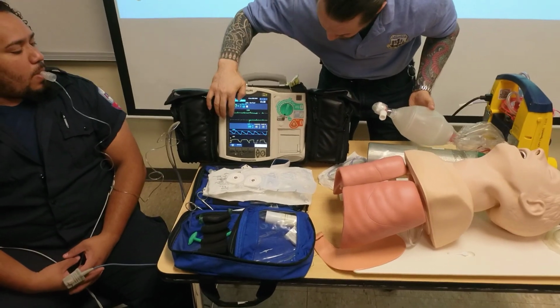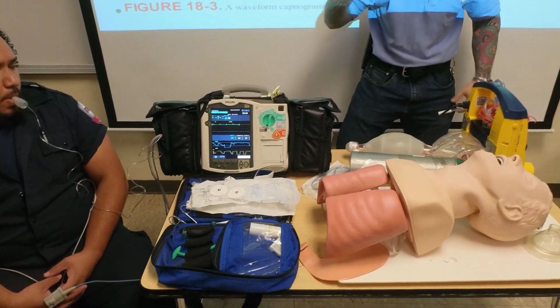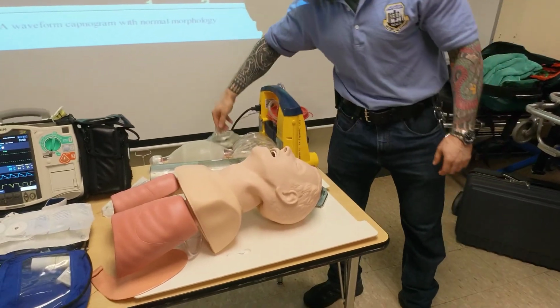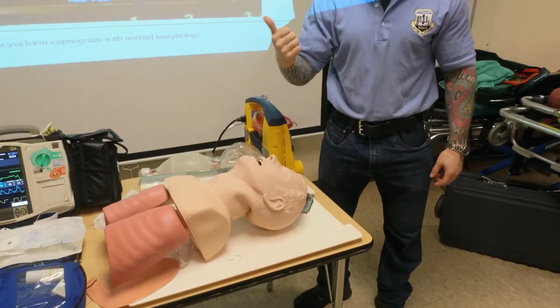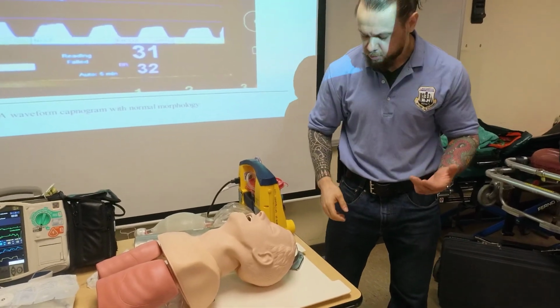So we want the EKG, the pulse ox, and the end-tidal CO2. I usually turn on my audible alarms. I'm not going to do it now because I want you guys to hear. The next thing we're going to do is check the patient and determine the indications. Failure to maintain or protect, failure to oxygenate or ventilate, and expect clinical course to decline. You don't need all three.